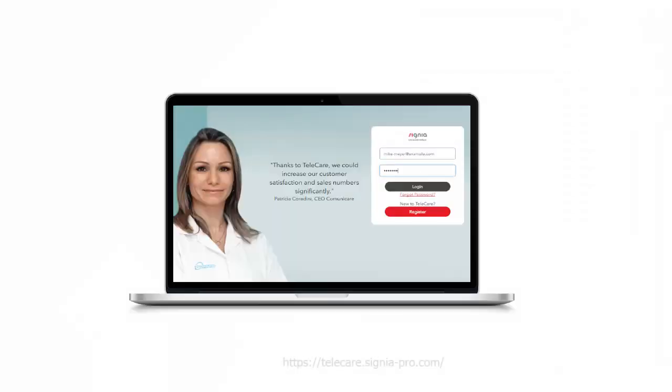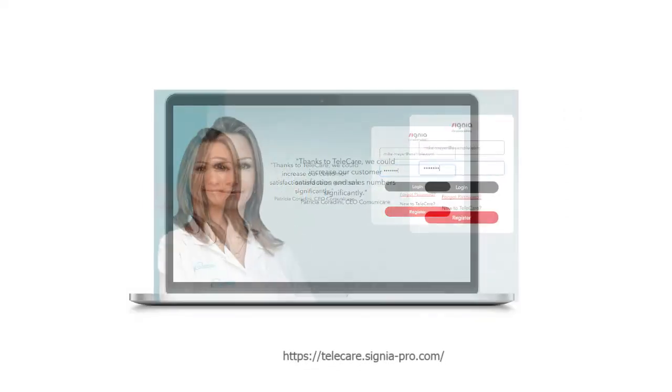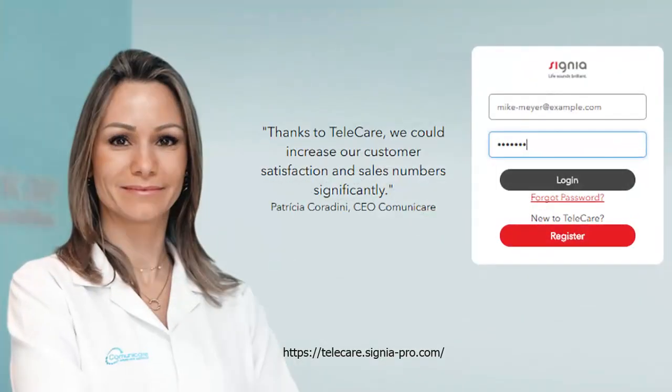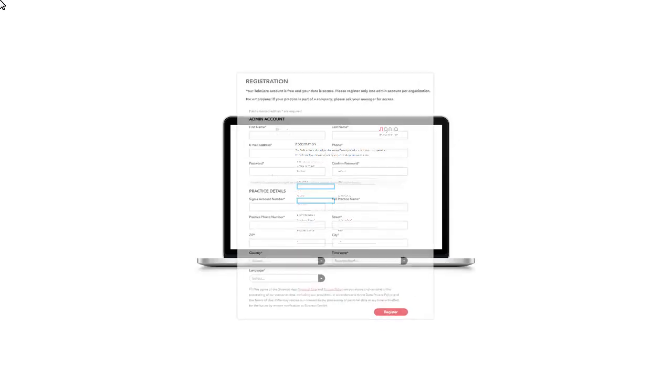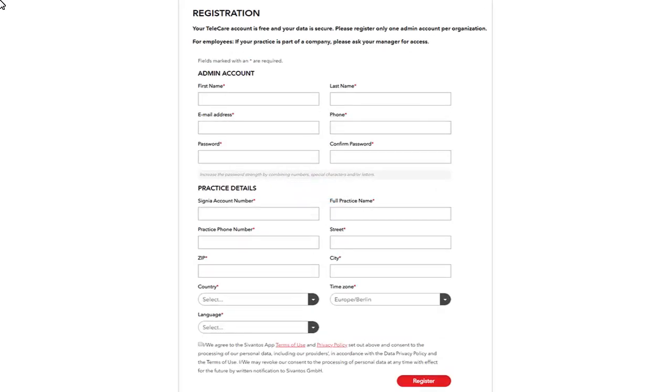Open the Telecare Portal first and click Register. Please complete all required fields on the registration page.